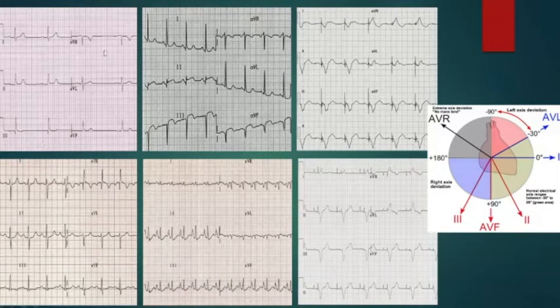And when you have this case here, what's happening? We have a problem with P wave height, right? How many small squares are 120 milliseconds? 3. So if the wave is below 3 small squares, it's okay. If it's more, then you have a problem with it.